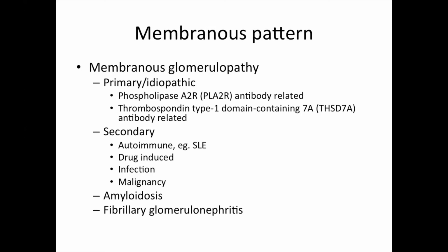In both of these cases, in amyloidosis most likely we will have monoclonality. In fibrillary we will have IgG deposition as well as deposition of both kappa and lambda, and fibrillary will be positive for DNAJB9. Amyloidosis will be positive for Congo red, if it is for example light chain. In both of these cases on EM we see fibrils.